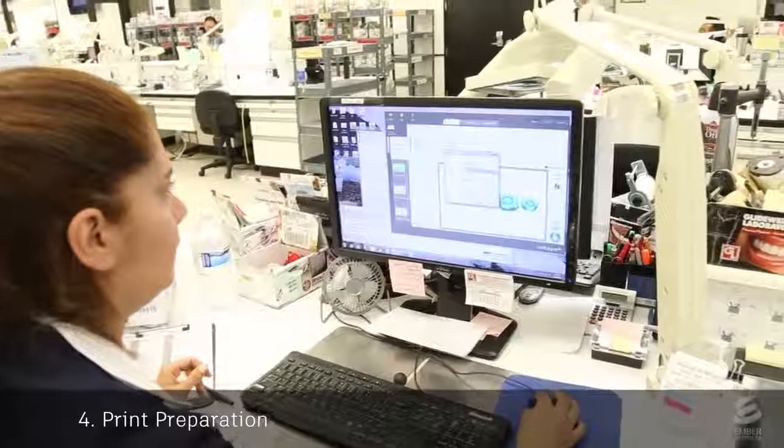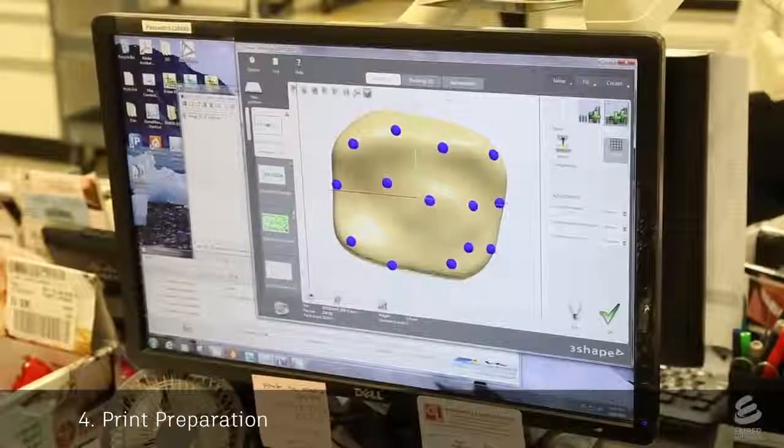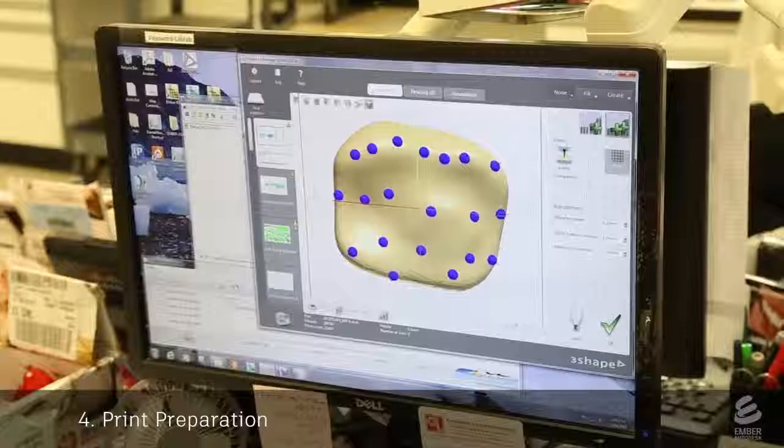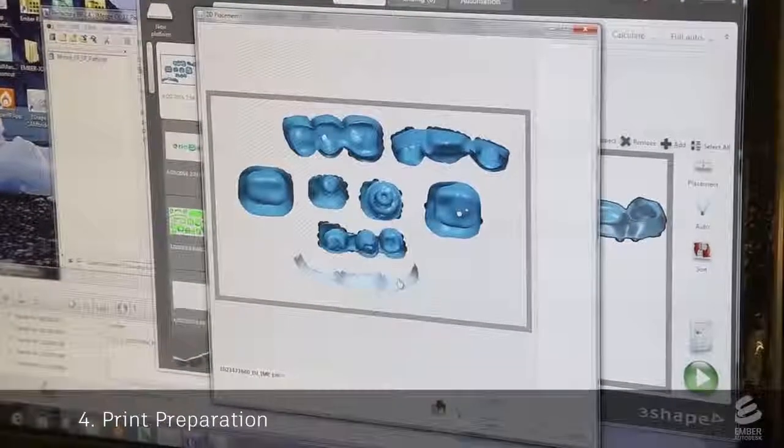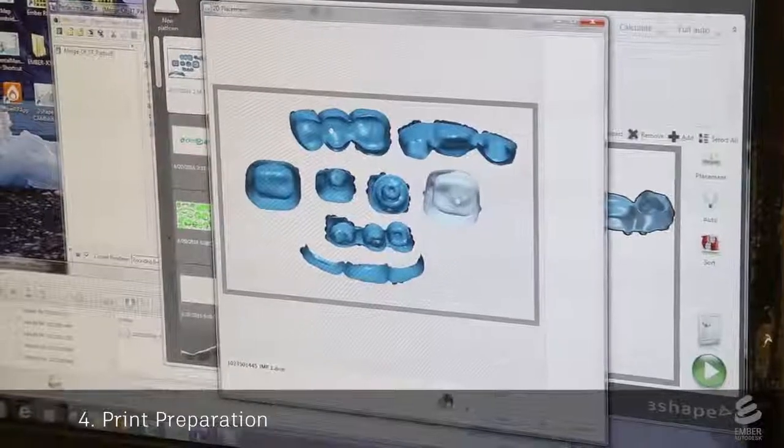Next, the models for the crowns and copings are prepared for 3D printing on Ember. A tech uses special dental software to add supports onto the model. Then the models are tightly arranged in a plane. This nesting allows many crowns to be printed at once, improving the efficiency of the process.